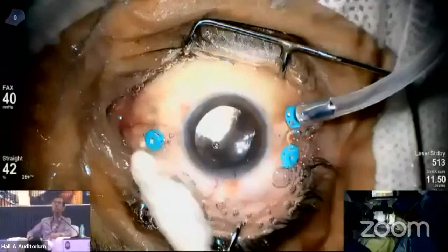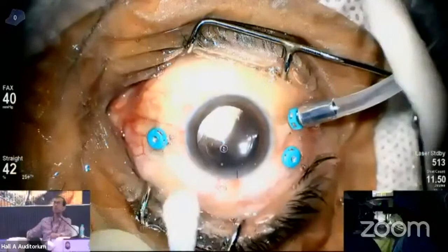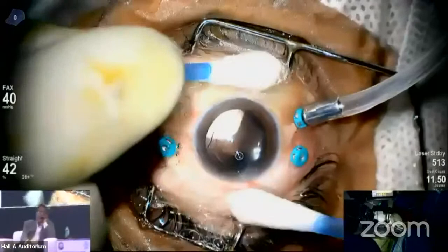But yes, when it is an old case, there is a lot of PVR or multiple breaks, especially going into the inferior quadrant, then you can go on and inject oil. And I think as the confidence of the surgeon builds up, slowly you change over from oil to gas. Regular follow-up is very important in these cases.